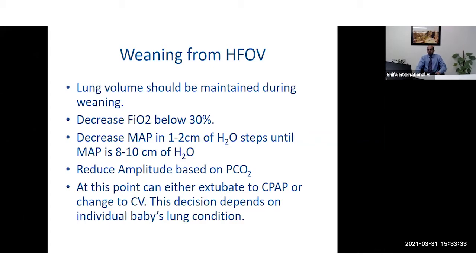And once we are down to these settings where the FiO2 is less than 30%, the MAP is around 8 to 10 centimeters of water, the CO2 is good, the oxygenation is good, at that point, most of the time, the babies will be changed from the high frequency ventilation to conventional ventilation.